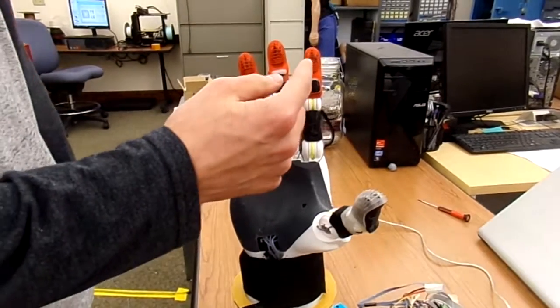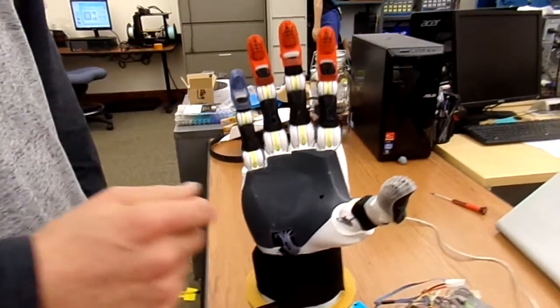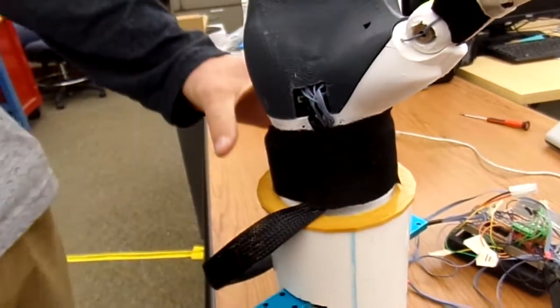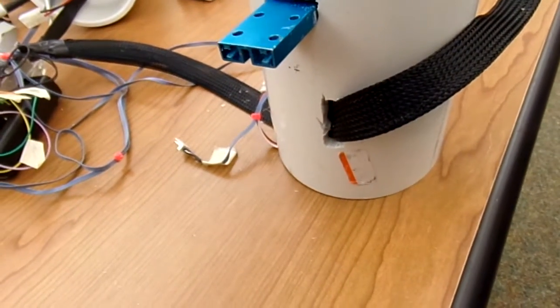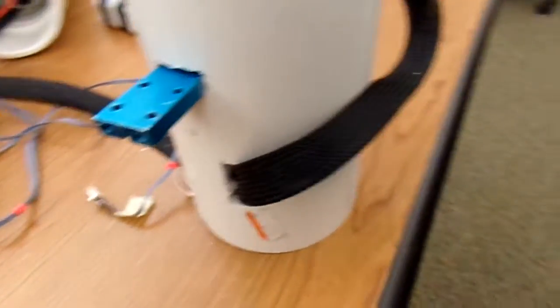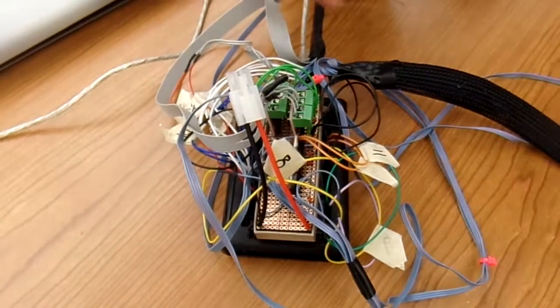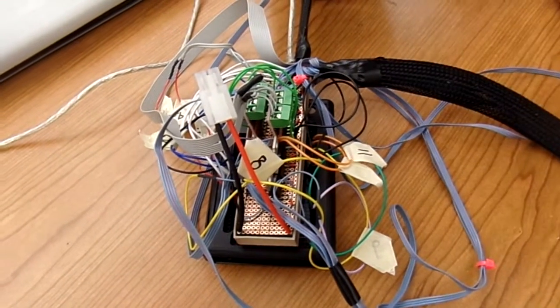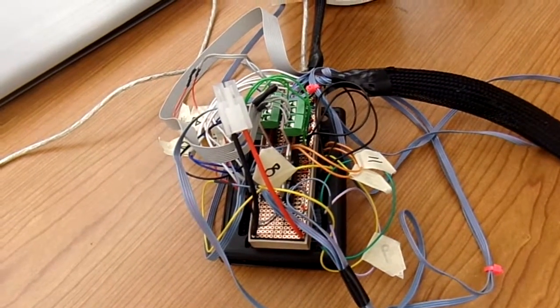The wiring for the force resistors runs through the fingers, through each joint, and then into the palm. The wiring for all the servos runs through the palm as well, and all of this exits at the wrist. It then enters the braided sleeving, which runs through and enters our wrist housing right down here. This then goes over to our main control unit, where we have a board with everything soldered together, including a couple H-bridges and some voltage regulators to drop our voltage from 7.4 volts that the servos run on to 5 volts for our other components.